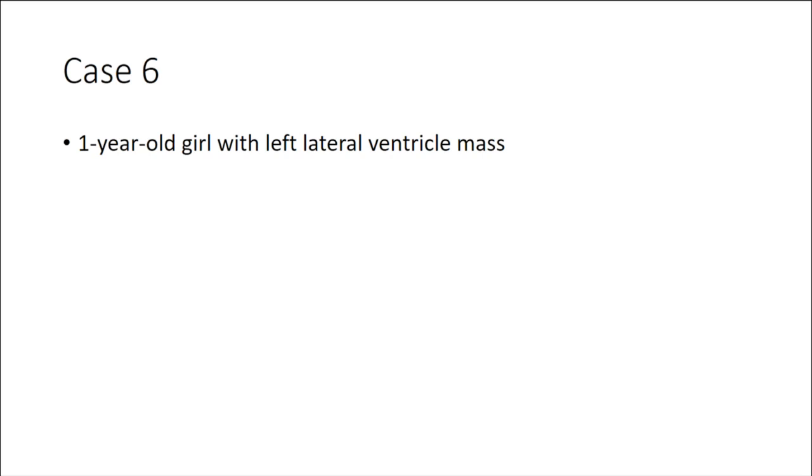Moving next to case 6, 1-year-old girl with a left lateral ventricular mass.